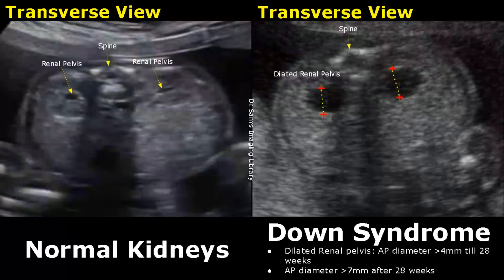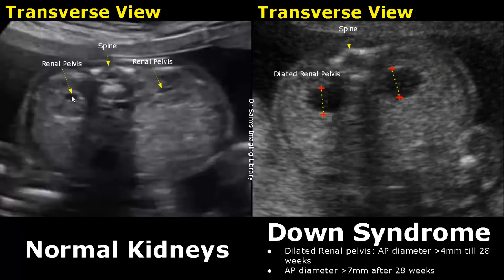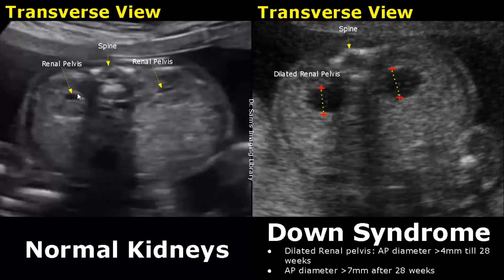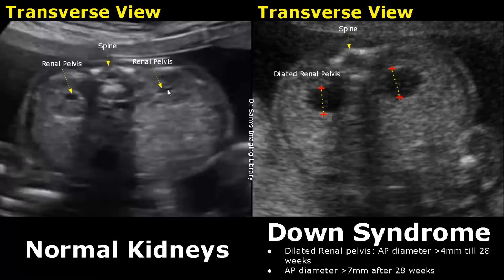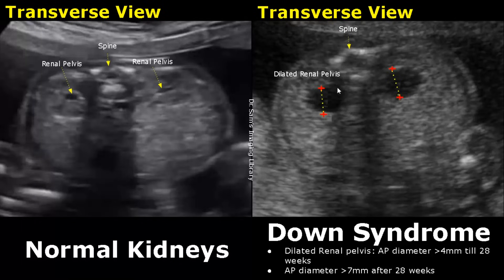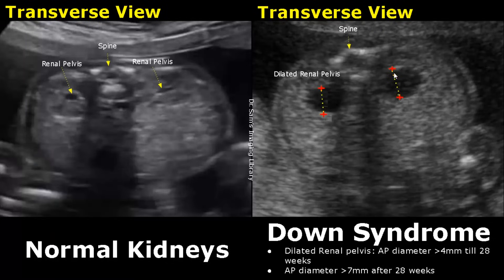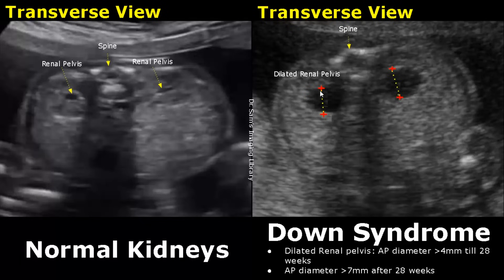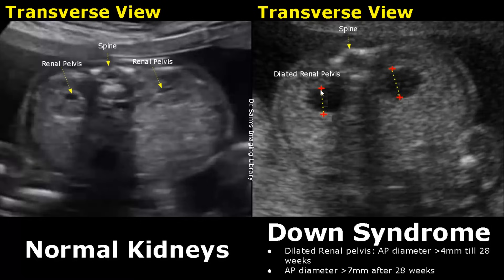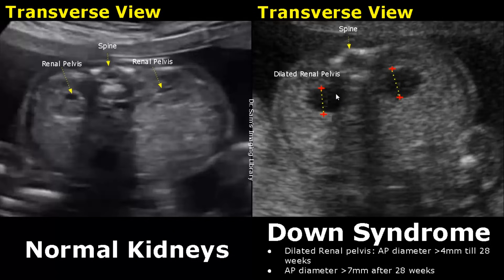This is a transverse view showing normal fetal kidneys. We can see the renal pelvis in each kidney — the anechoic area is the renal pelvis. Over here we have a dilated renal pelvis: the AP diameter is more than 4 millimeters until 28 weeks, and more than 7 millimeters after 28 weeks. This may also be associated with Down syndrome.